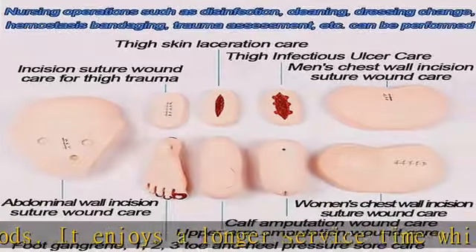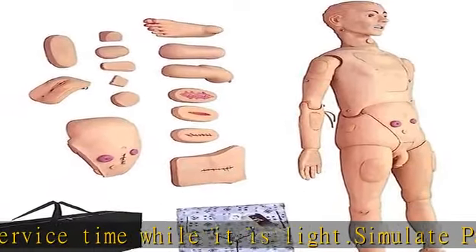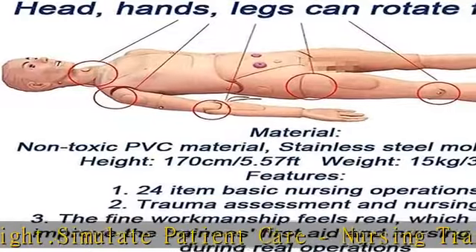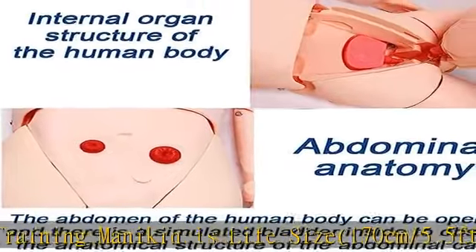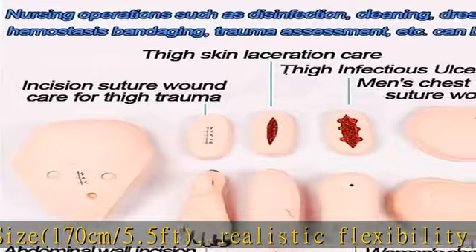This nursing skills training mannequin has been widely used as a teaching aid in clinical, emergency, and nurses' routine training. This full-featured nursing mannequin imitates the normal posture and range of physiological activity of the human body, which helps nursing and medical professional training design.